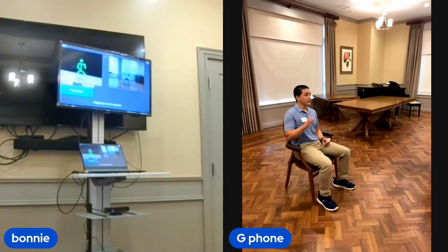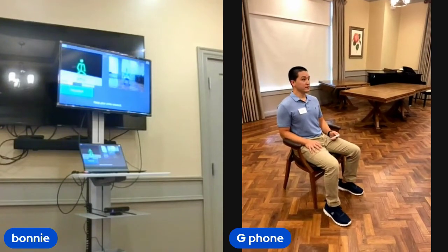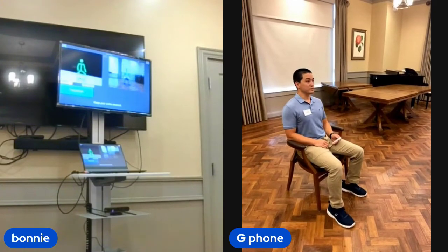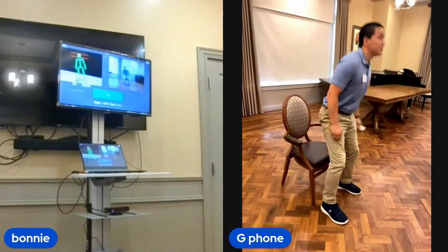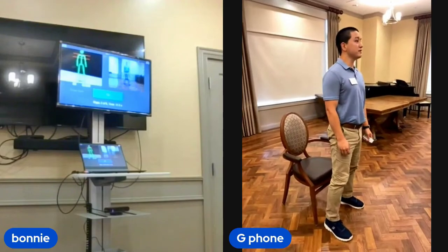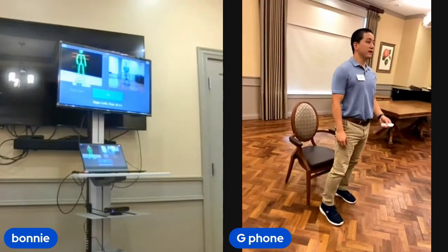So for say someone with a right hip replacement, they will probably be favoring their left leg. They're going to rely on their left leg more to do these sit to stands. So let's see if I can replicate this a little bit. Here, I'll do 5 times standing and sitting, and I'll try to replicate what it would look like for a total hip on the right side. So I'm going to come to the left, up, 1, favor to the left, 2, 3. It lets you know at the top if you've made each rep. You can see here, 4, and 5.